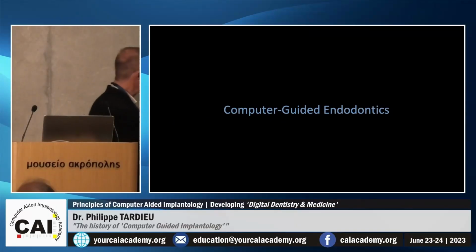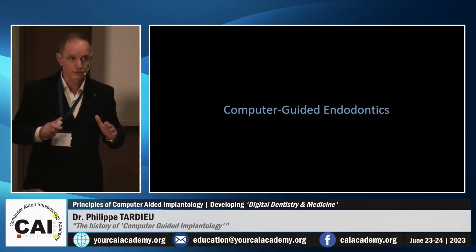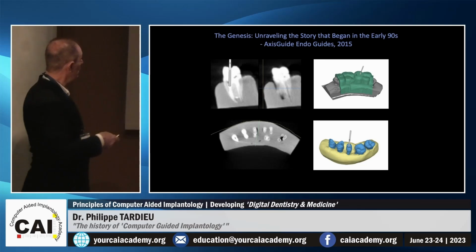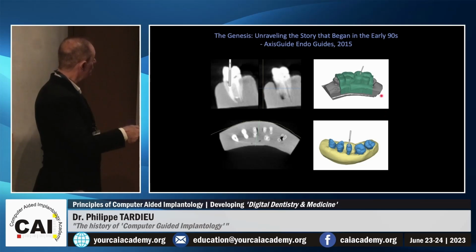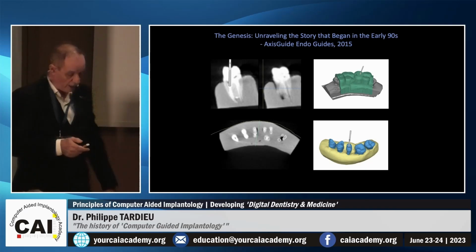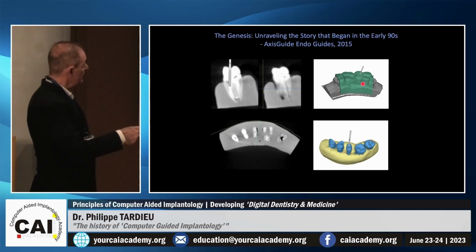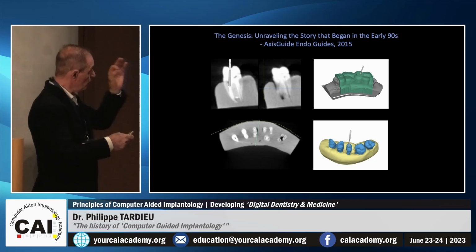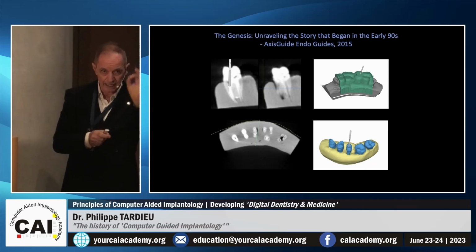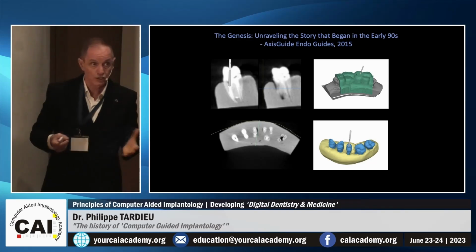So what we have been doing also, and I am not doing any root canal treatment, I don't know how to do that, but we had a request from some people to use guides to find the root canals. And we are making guides like this. This guide is placed on top, and you have a small opening, and when you go inside, you are exactly inside the root canal. No need to look for it, it's directed, and it's working very well.